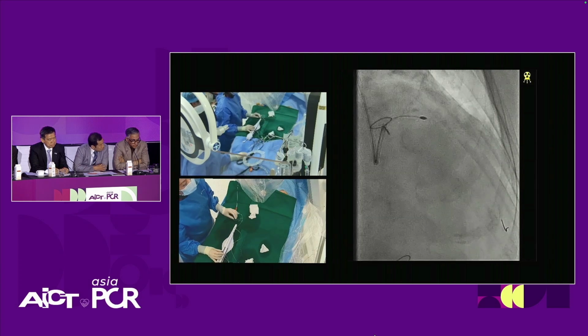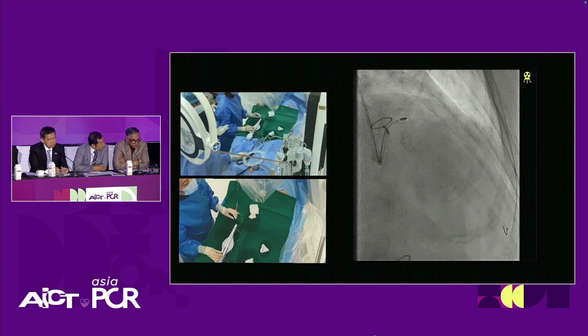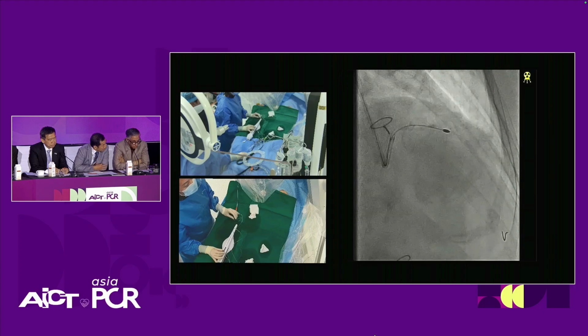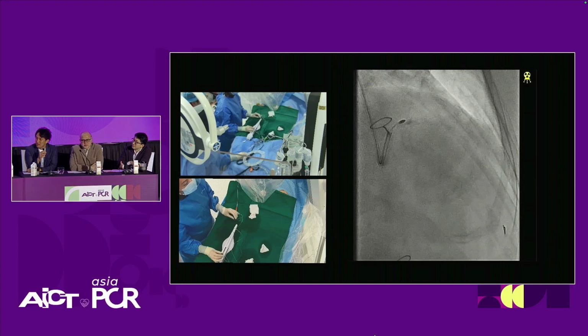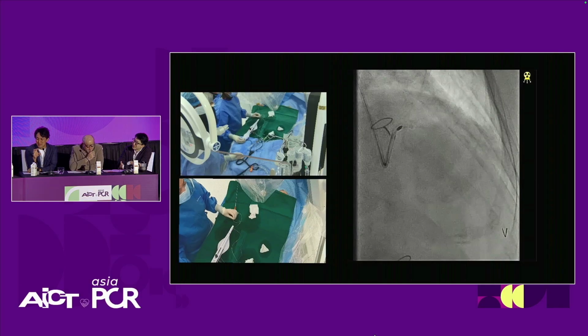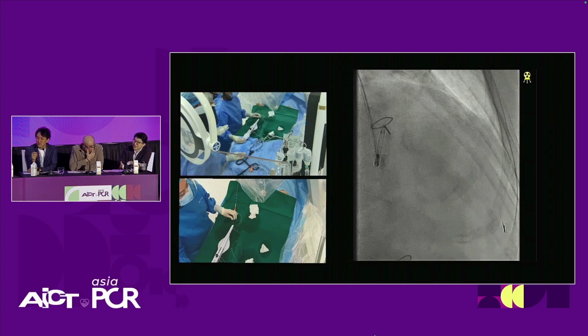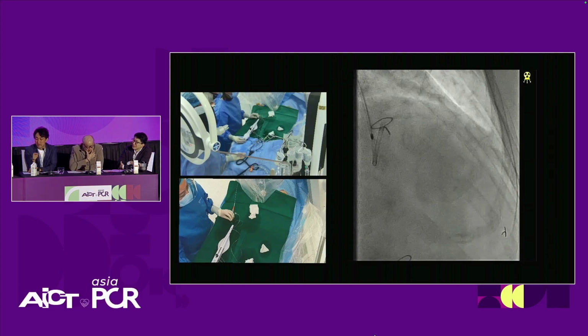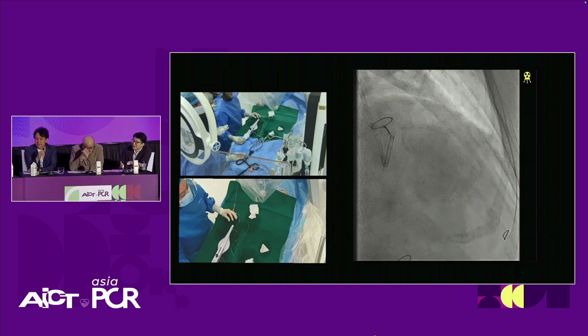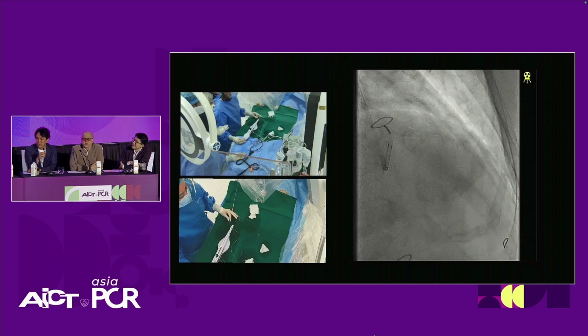Dr. Tori, Japan does quite a fair amount of rotablation, and sometimes quite aggressive. 1.75 looks big to me, but is this big enough for Japanese style? Thank you for your question. Of course, it depends on the vessel size. After you use this 1.75 rotor burr, check the IVUS. If the modification is not enough, don't hesitate to size up to the 2.0 burr.